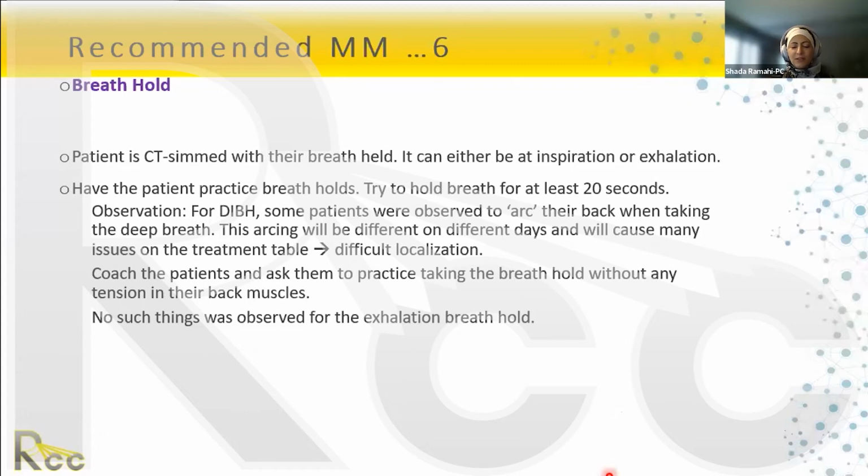Now let's do another test. Take maximum or deep inspiration, and hold your breath. At least for me, my back arcs. In the exhalation part, it's more relaxed. So depending on which breath hold you're using, you can have different problems in patient immobilization.